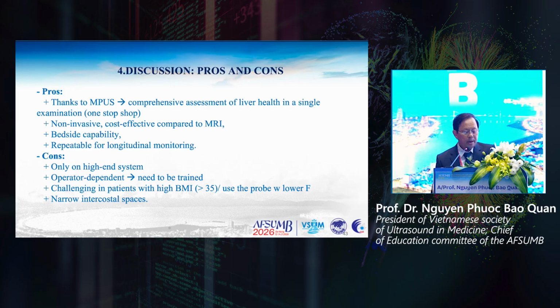But multi-parametric ultrasound also has disadvantages. The technique is only installed in high-end systems. I think in the future manufacturers can bring many of these functions and technologies to low-end or medium-end systems.